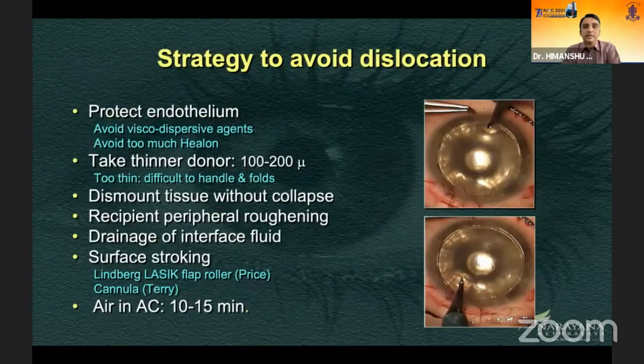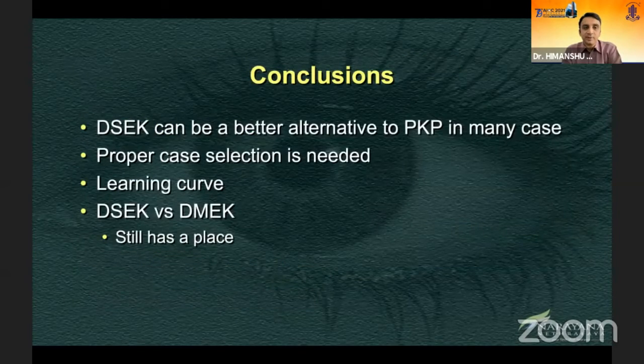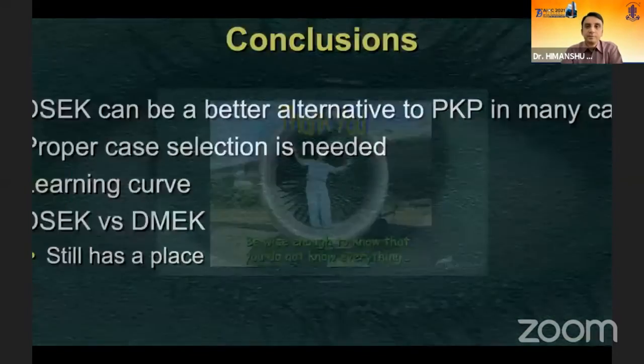To conclude, DSEK can be a better alternative to PKP in many cases. Proper case selection may be required. There can be a small learning curve. There are indications where we would prefer to do DSEK over DMEK. Hence, DSEK still has a place in the current practice. Thank you very much.